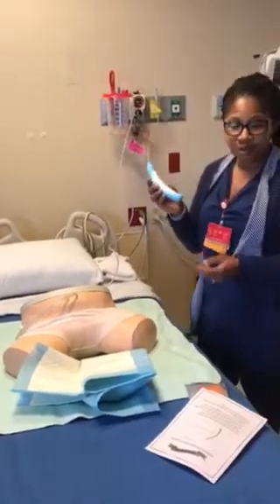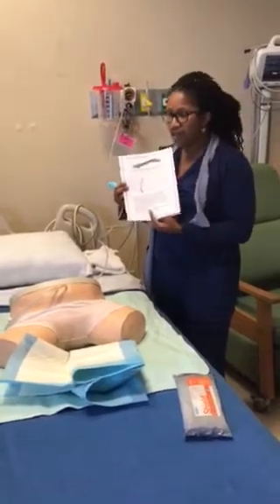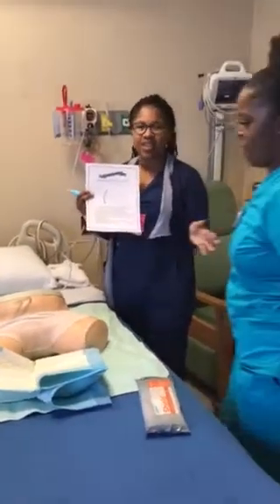First thing is the PureWick. It's our new external female catheter. We've been doing a lot of in-services, and I'm going to show you today how it works. This is Lanisha, PCT, from 4South, so she's going to help me.